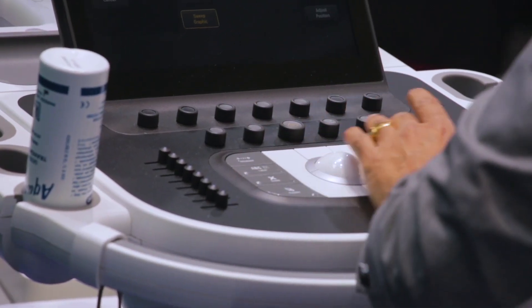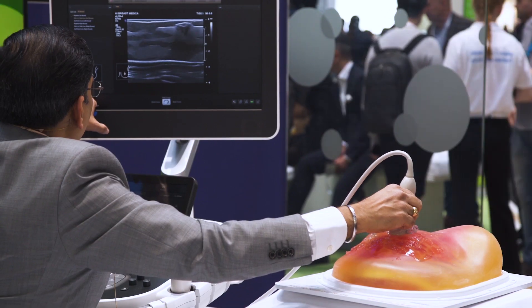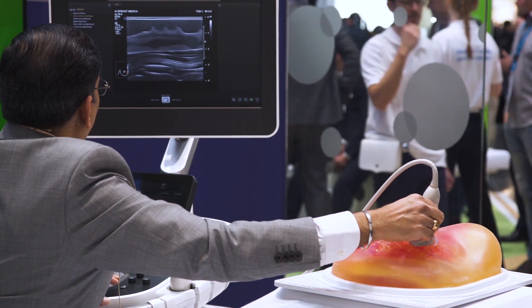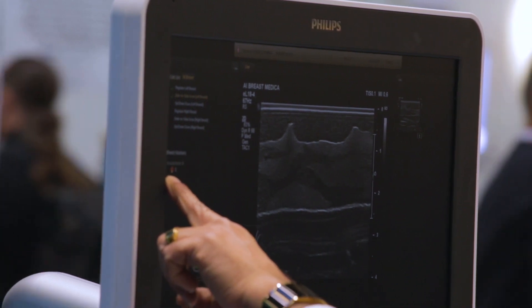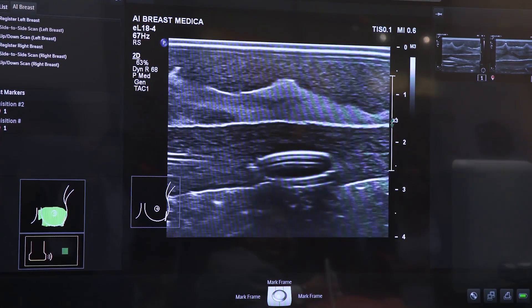Now I'm going to perform the scan by scanning the breast in a side-to-side fashion. While I'm moving the transducer, I'm also acquiring loops, as you can see on the screen. AI Breast allows visual mapping of the breast anatomy, which helps in documenting the full coverage of the breast. Also, while acquiring these images, if you see any particular pathology, you can quickly bookmark that image for a quick review at a later stage.